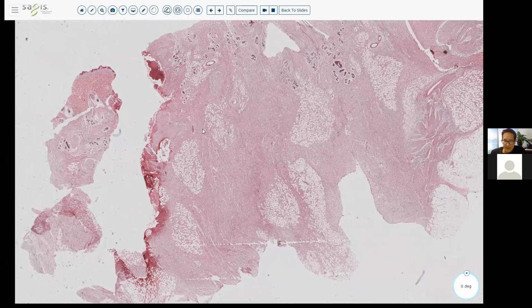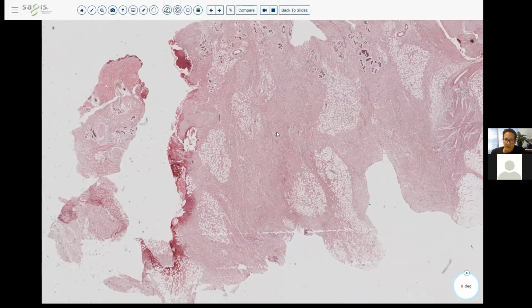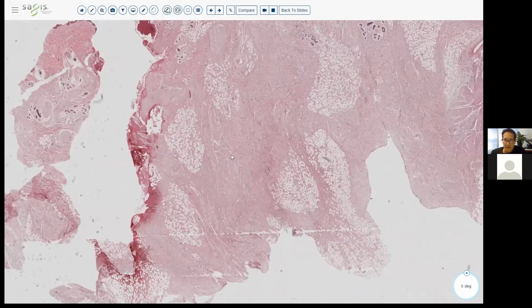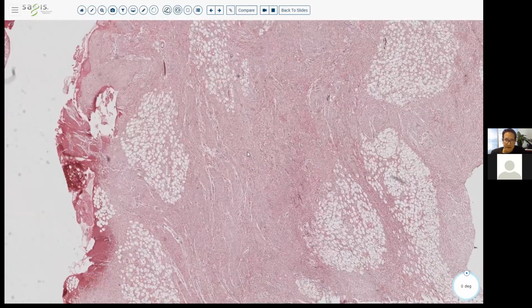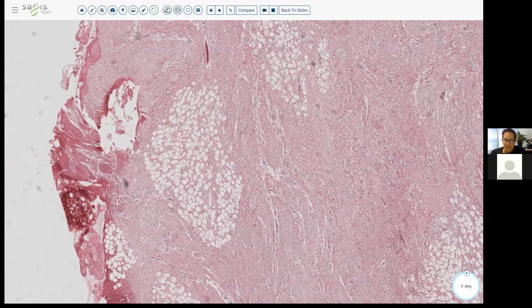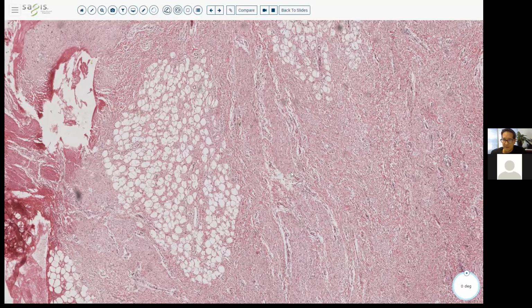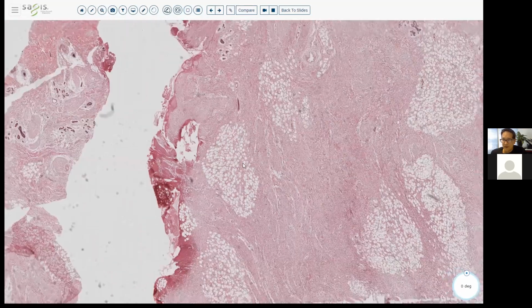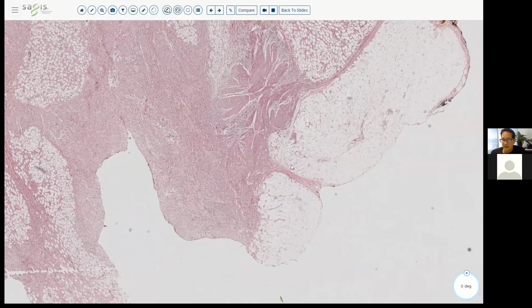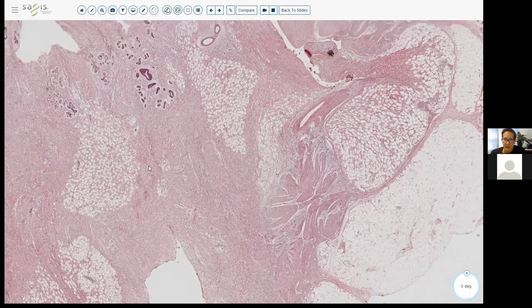In this case, the fat is actually part of the lesion. This is a hamartoma, so it's not a true neoplasm. It's just having cells growing where they shouldn't grow, but they should not continue to grow over time. The fat cells are just growing within this lesion. It's not really wrapping around the fat. At the edge, you can see the normal fat, so it is pushing on the normal fat, but right next to it here, these fat lobules are just part of the hamartoma.